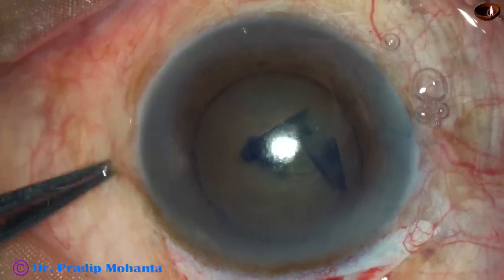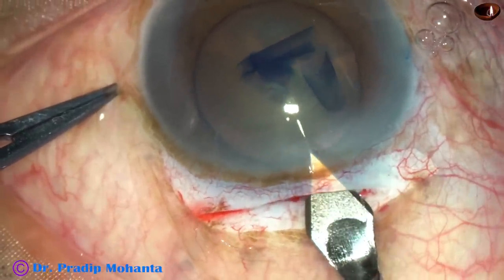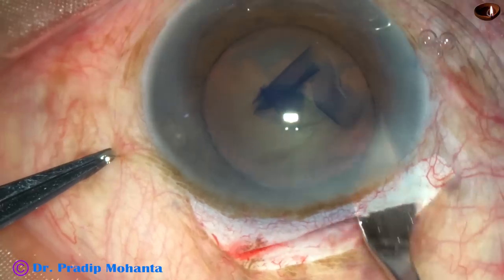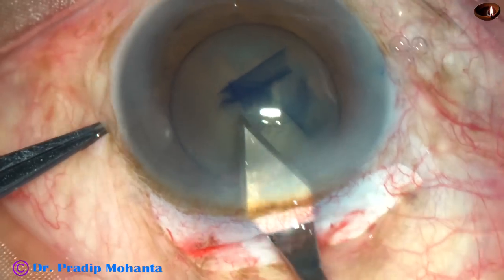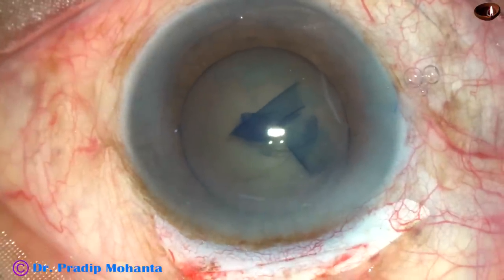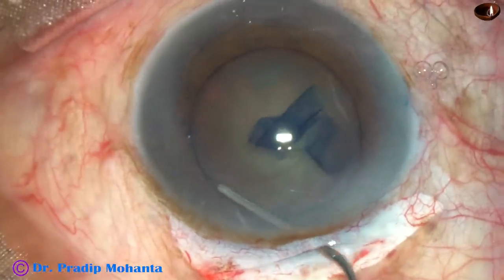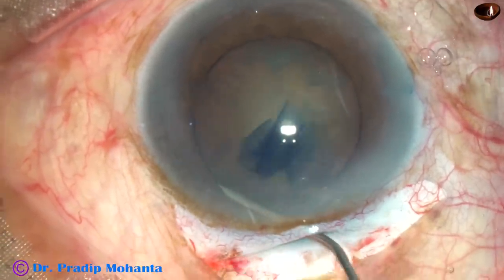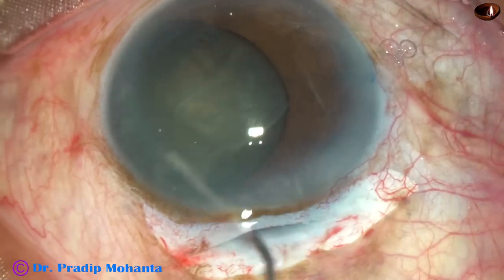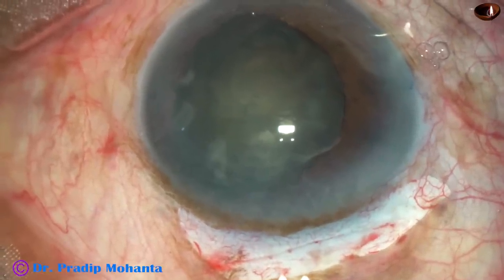Now the sclerocorneal tunnel is opened. The keratome goes at the anterior extent and then goes down, then sideways — cut as you go forward — opening the tunnel. The inner opening is a little larger than the scleral opening. Now do hydrodissection with a 27-gauge cannula. Inject fluid very gently and you will see the nucleus prolapse — the pole will prolapse if the rhexis is about 6 mm. Now inject visco.